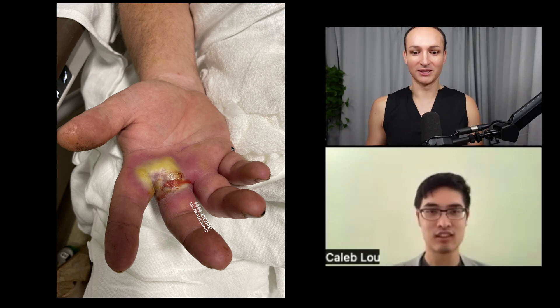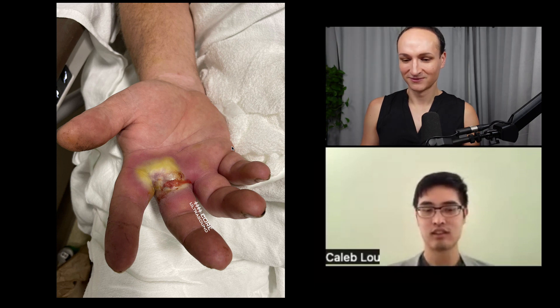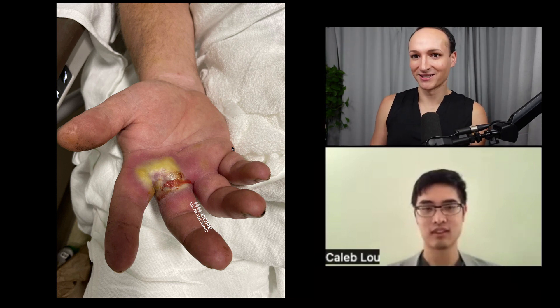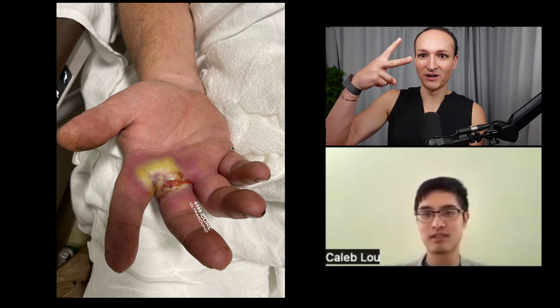Do you know this has a name? It's a collar button abscess — a specific abscess in a specific spot where it goes through and the fingers are stuck out. I've literally only seen it once in this case.